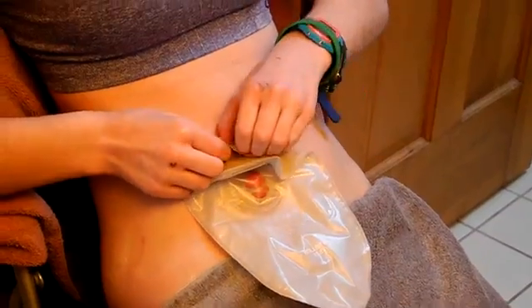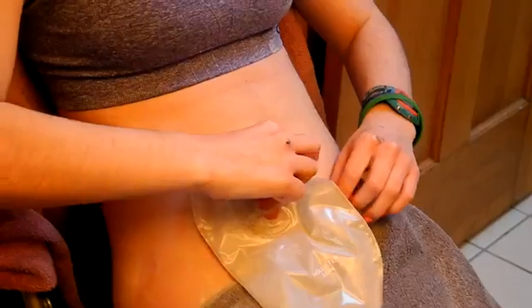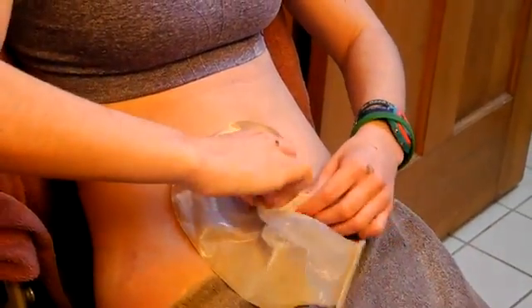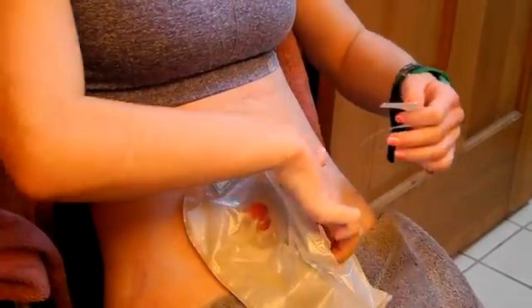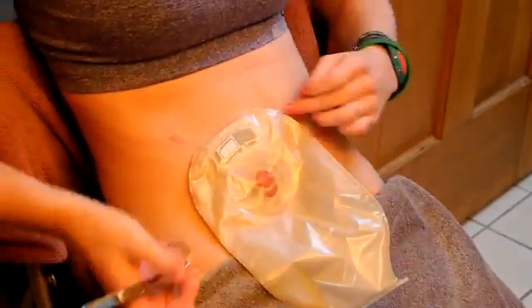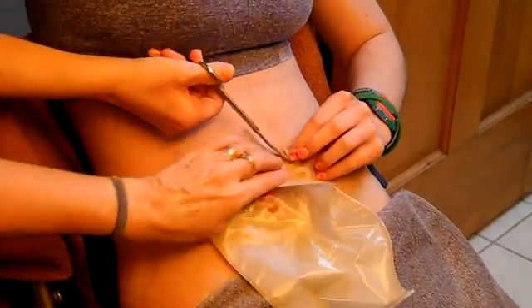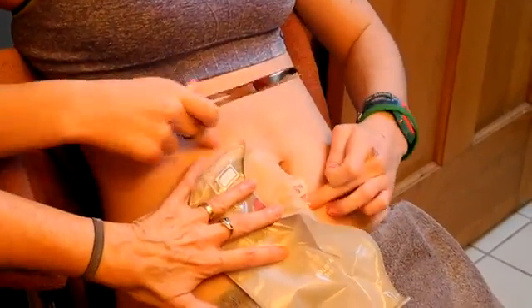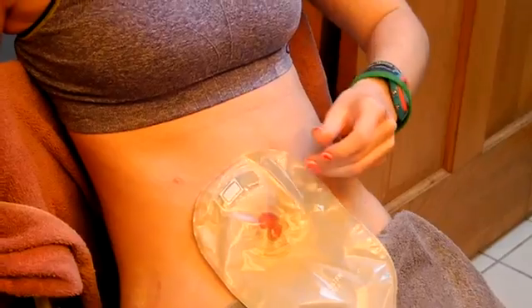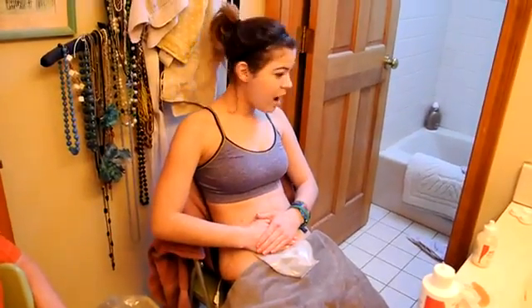Okay, just like that. Mine is actually really close to my belly button, my stoma is. So sometimes I have to cut a little bit of the waterproof barrier because it goes over my belly button, and when it does that, it doesn't get as good of a seal because it has nothing to stick to. So I'm just going to snip, snip, snip. Just a little bit so it goes around it. And then you throw this away. You hand your helper the scissors and you just keep warming it up, warming it up.